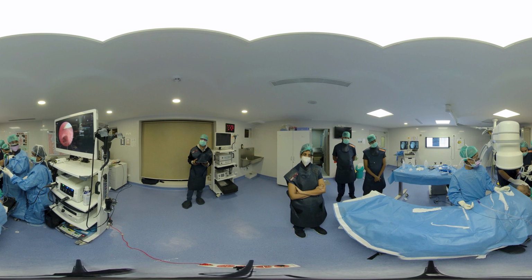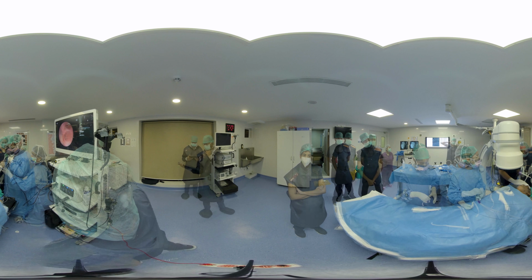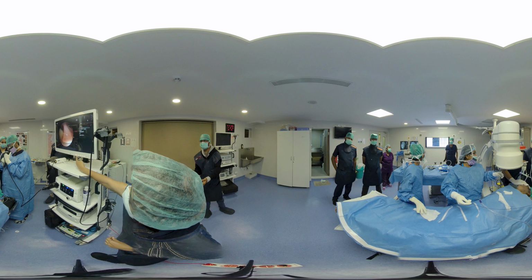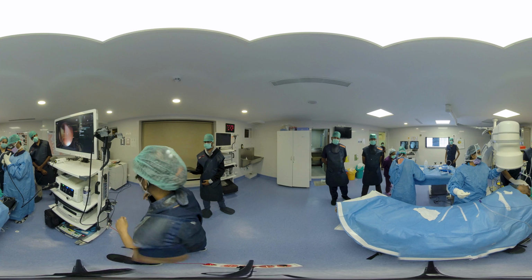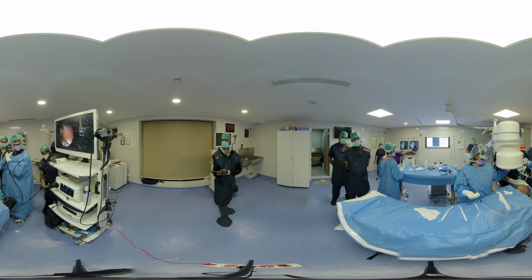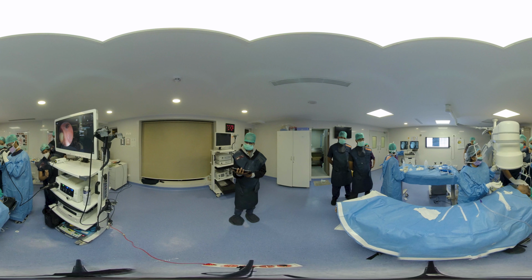Don't remove my Fogarty now. Now you can see that I am passing the radial probe into the posterior subsegment.